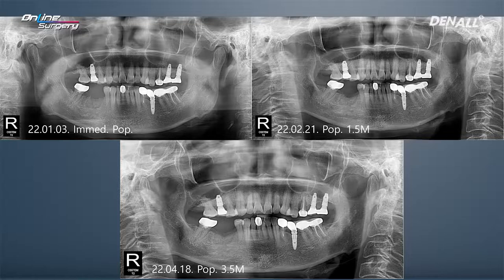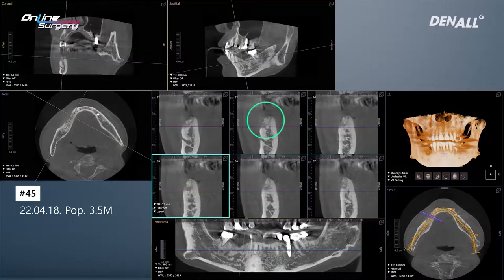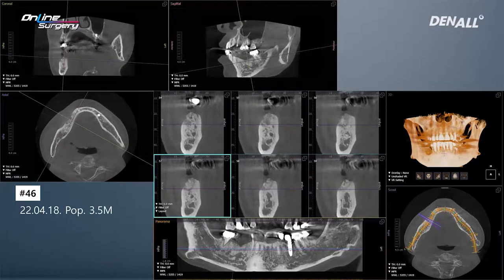Looking at the CT at 3.5 months, the surgery site was assessed. In number 45, there is slight bone remaining on the buccal side, but it was almost entirely resorbed. In number 46, AOS collagen was used and you can see the form is being maintained, but it's difficult to say that new bone formation has occurred completely.